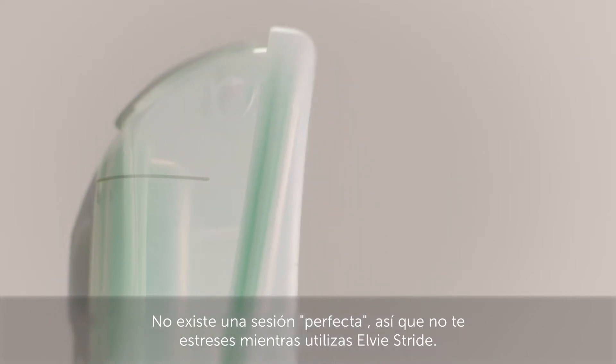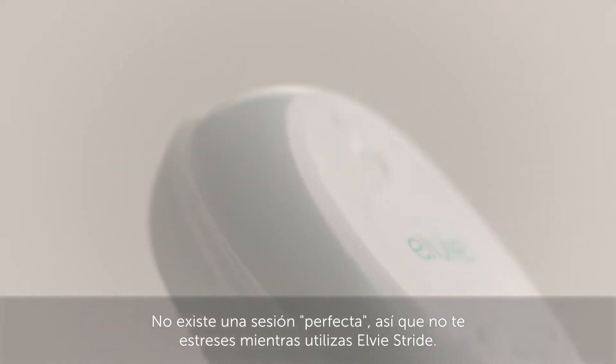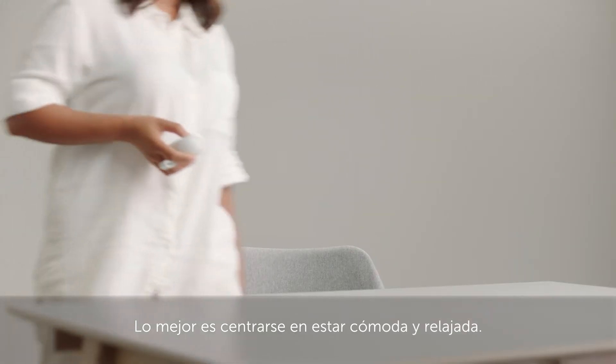There's no such thing as a perfect session, so please don't put any pressure on yourself while using Elvie Stride. It's best to focus on being comfortable and relaxed.